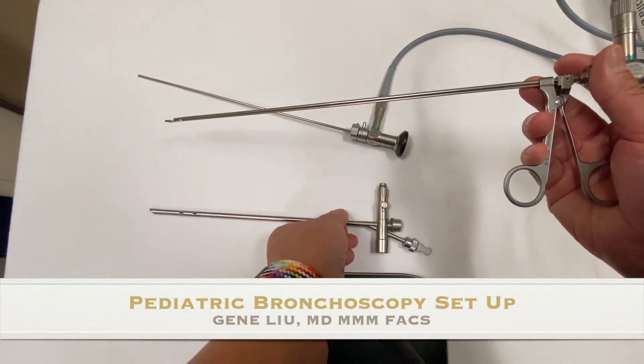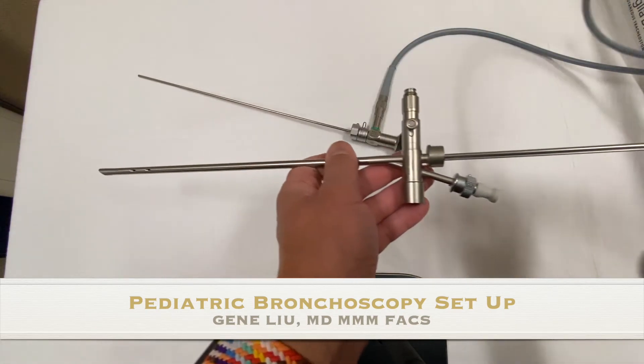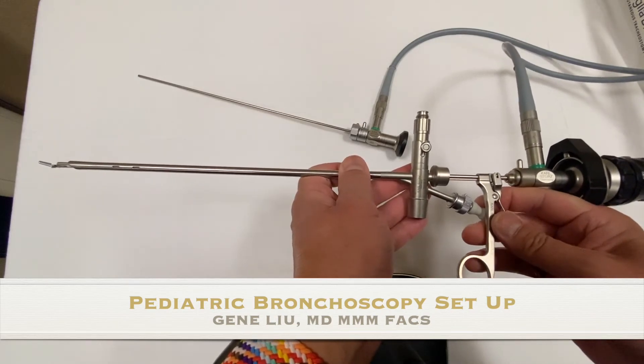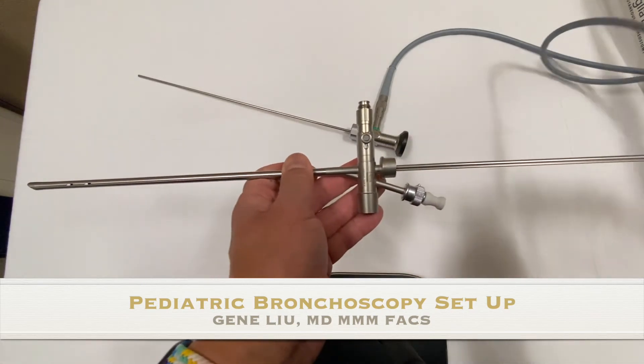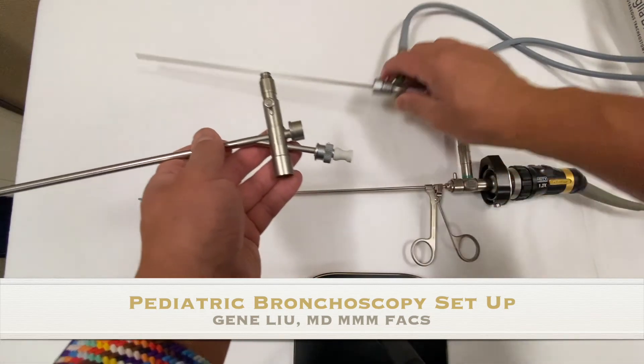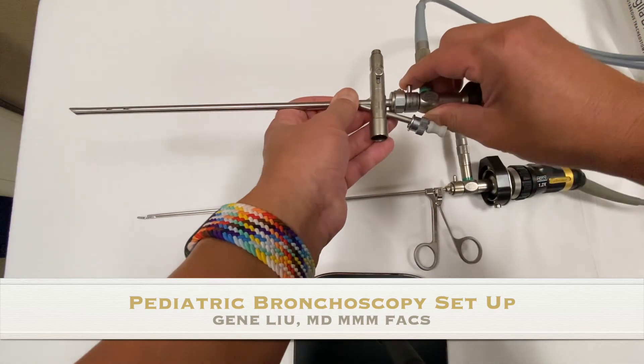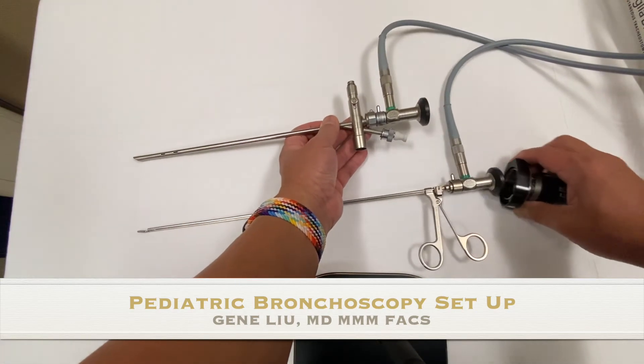Now you're ready to go back in quickly to get to the foreign body and grasp it. Once you pull everything out and have removed the foreign body, you can remove the grasper, put your telescope back into the bronchoscope, reattach the camera, and you're ready to go again.